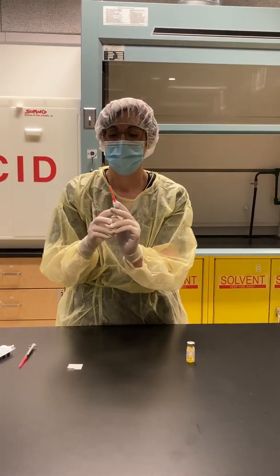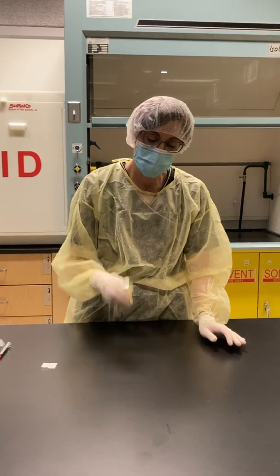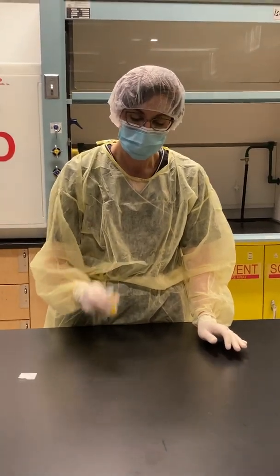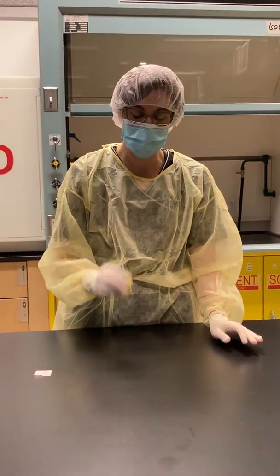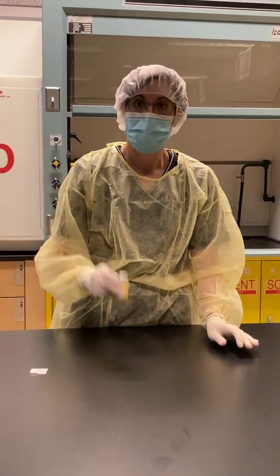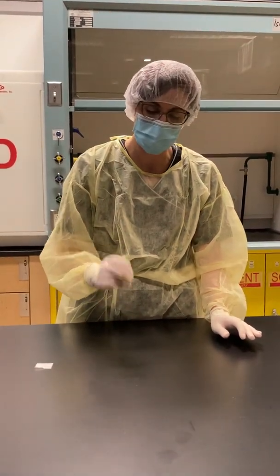Cap my needle. Now I'm going to shake my vial until all the drug has dissolved. It is very important to make sure that all the drug has dissolved, as this will prevent a patient from getting particulate contamination in the CSP they are receiving.